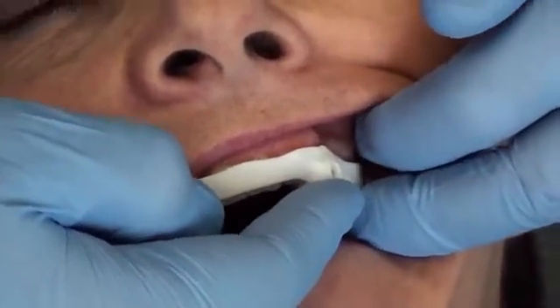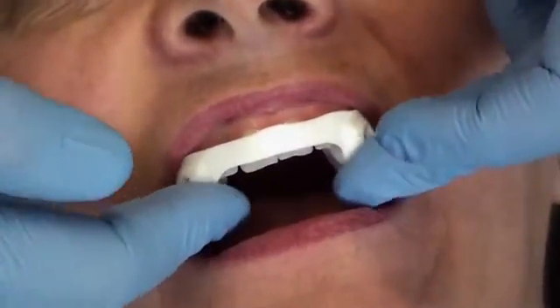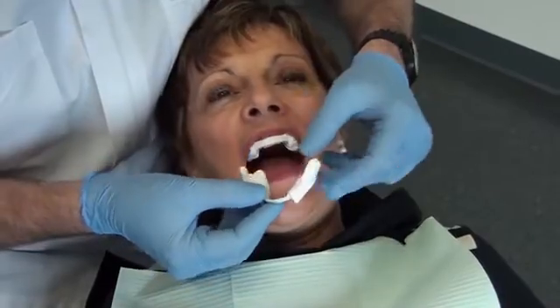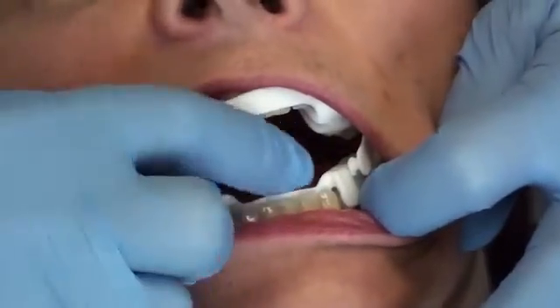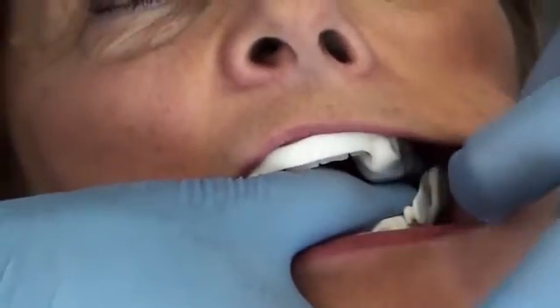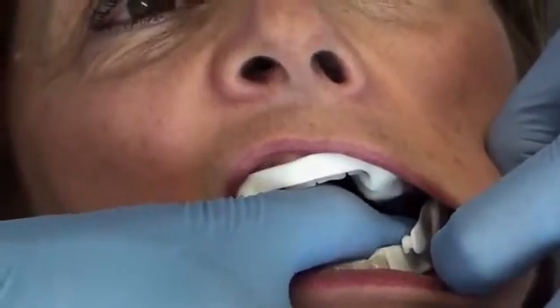We repeat this step on the other side of the mouth. We observe a slight resistance, but it stays in its place and is well secured. To the patient: do you feel any pain? Is there a side tighter than the other? For the lower part, we must leave the upper part in place. We position the device next to the lower canine teeth, since they are not covered by the appliance. We simply press on each side while pulling the cheek a little to prevent the mucous membrane from being pinched under the device.